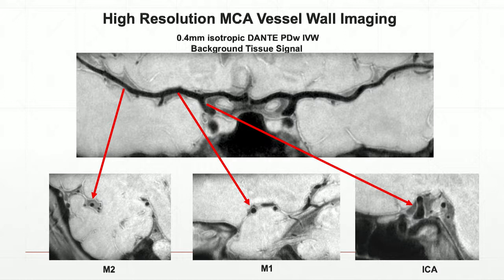through other techniques. The other thing I'd like to highlight is that when you look at this image, its background is the brain tissue, versus the carotid, which has more fibrous tissue surrounding the vessels. Being able to identify the outward boundaries is not going to be similar. In some cases it can be quite challenging. So that's another issue for intracranial vessel imaging.